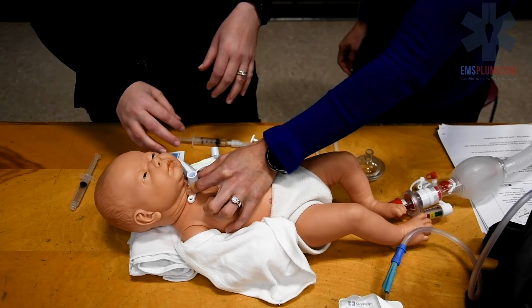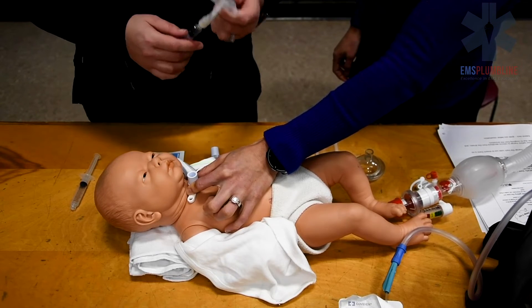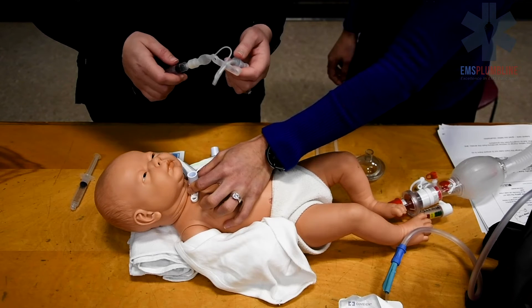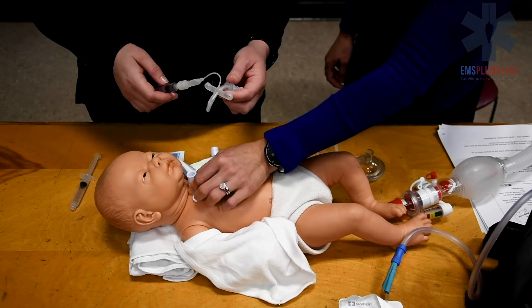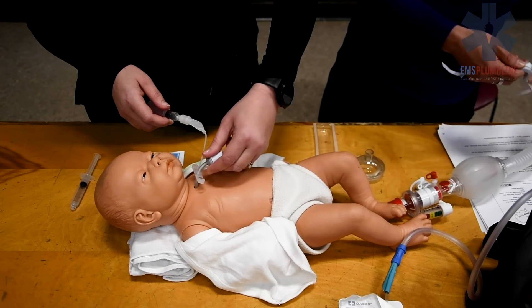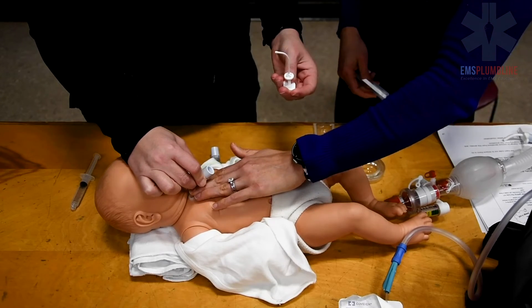Communicate with your partner the timing of the trach tube change. Count to three. Insert the new trach tube and immediately remove the rigid obturator. The obturator, when in place, is occluding the airway.